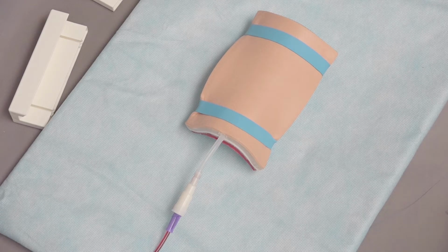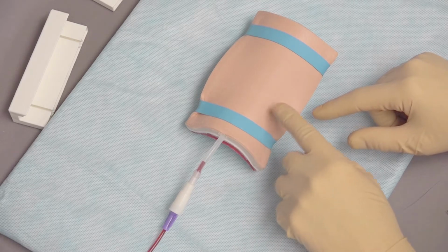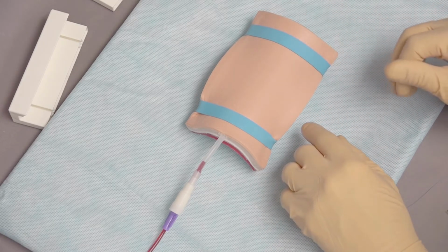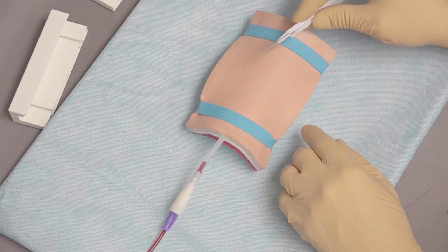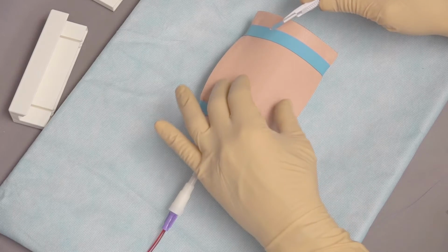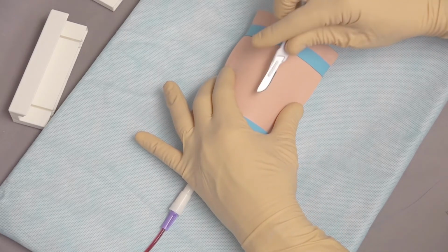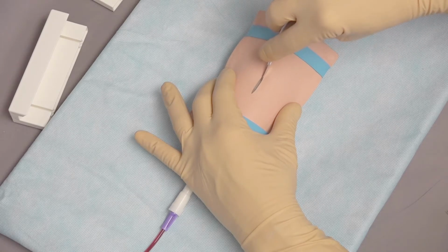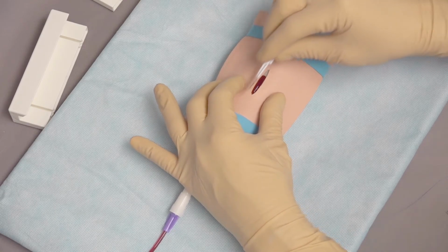We're going to turn the blood on now so that it's ready. Now you can appreciate that the blood started coming into the tube, but it won't actually come through until I cut the vessels because it's not primed. Take a scalpel blade, and then we're going to get ready to do the incision. So we'll put a little tension on the skin here just to make our incision. We're going to go right in the middle. And ideally, we're going to practice making our incision just through the skin, and now we have a bleeder.